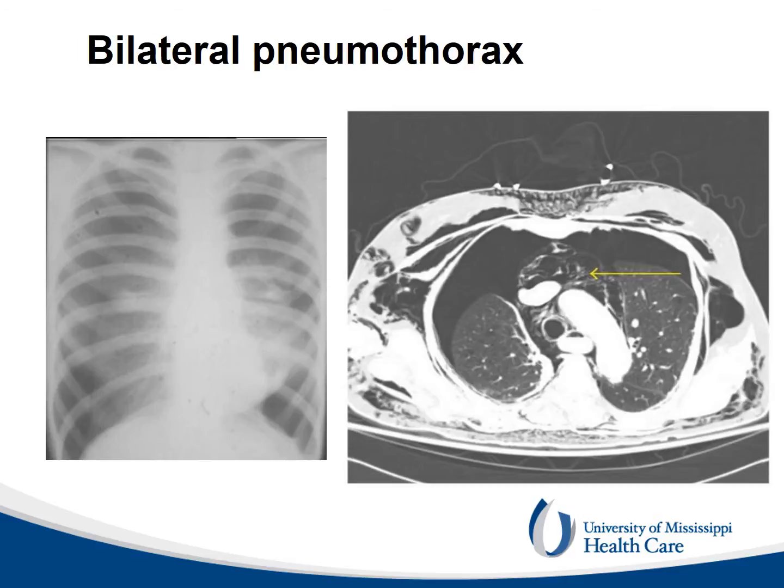Pneumothorax can be bilateral and usually from trauma. This chest CT also shows mediastinal emphysema in addition to bilateral pneumothoraces. Mediastinal emphysema develops from rupture of alveoli in the parenchyma adjacent to the hilum of the lung. Through the root of the lung, the air spreads to the mediastinum, surrounding the large vessels and bronchi, and can enter the pericardium, so-called pneumopericardium.